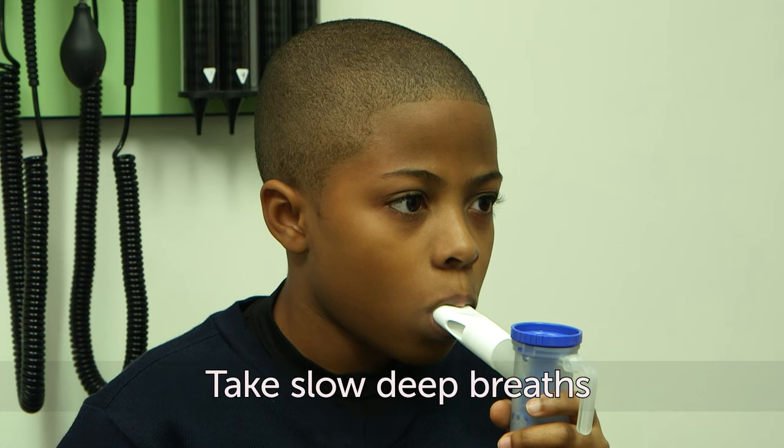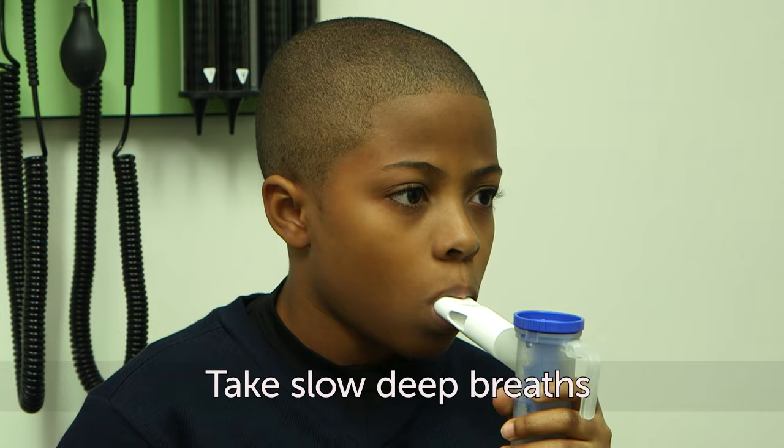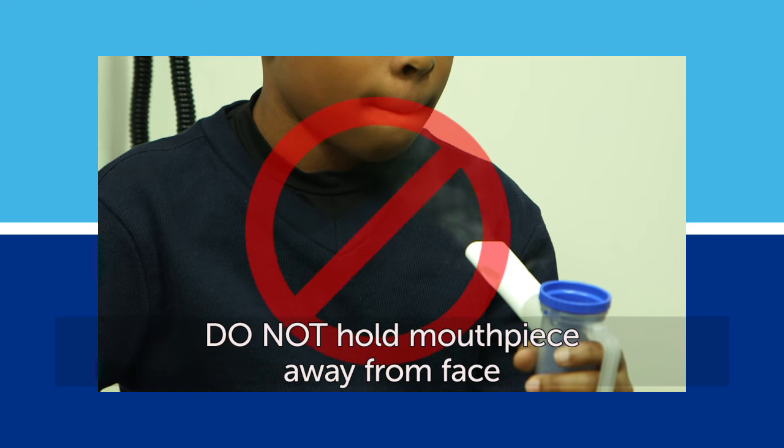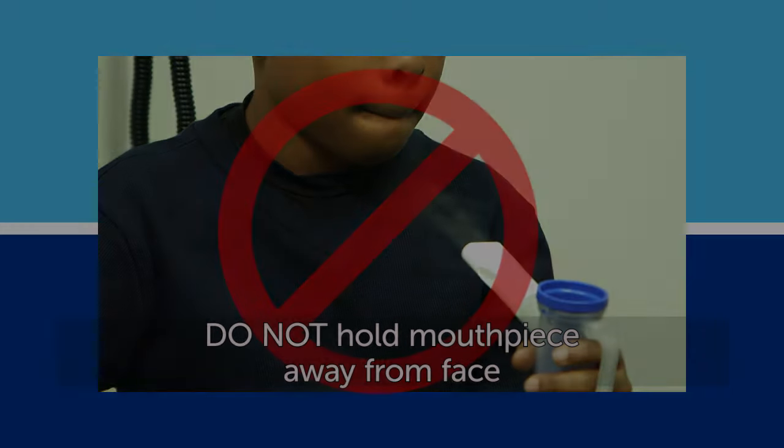The treatment will take 6 to 10 minutes. Take slow, deep breaths. It's very important that you do not hold the mouthpiece away from your face while breathing in the medicine.